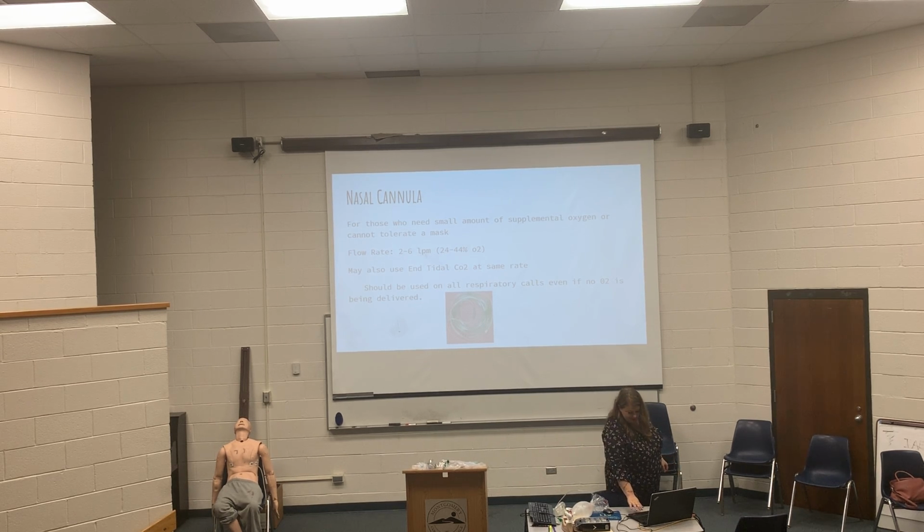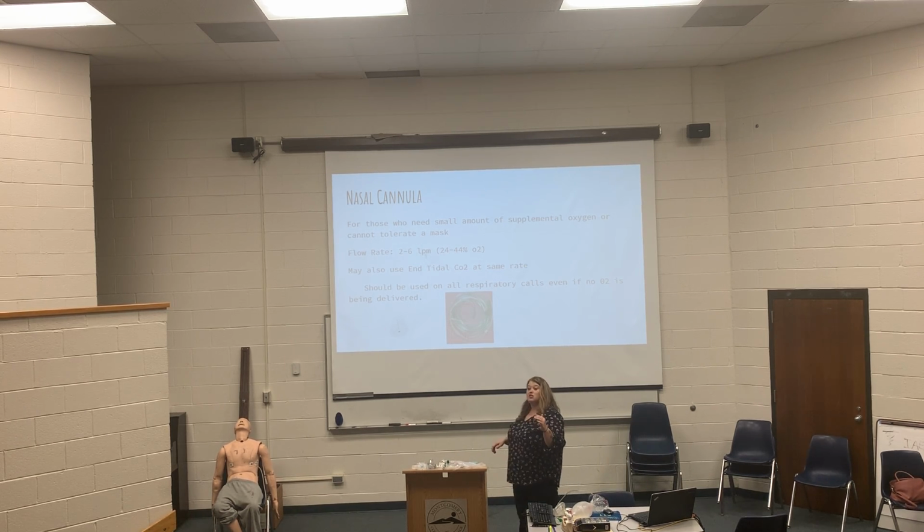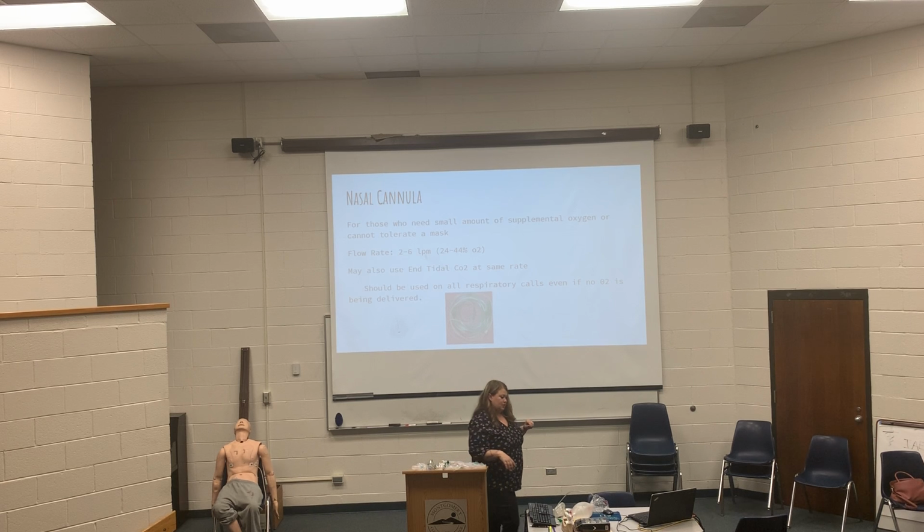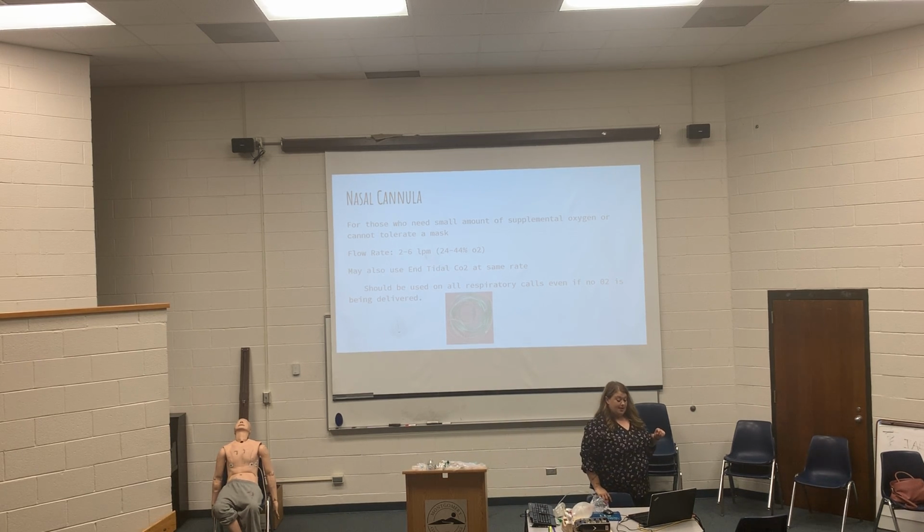Let's see what time we started, but the oxygen that you're getting from this is only 24 to 44%. So remember, I said 21 is the atmospheric oxygen concentration, so it's really not that much more. We do tend to use this more on chest pain patients. That's protocol. You start oxygen on them. Stroke patients are very good candidates for this because you want to make sure that they're getting oxygen and perfusing as much as they can. You want to save that brain, and you know they say time is brain. We'll run that when it comes to stroke stuff.